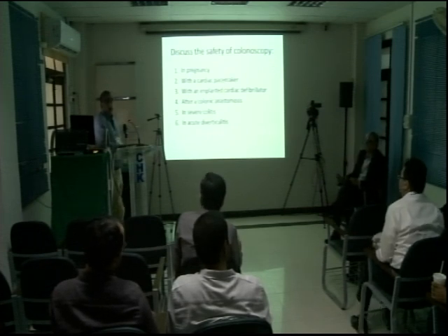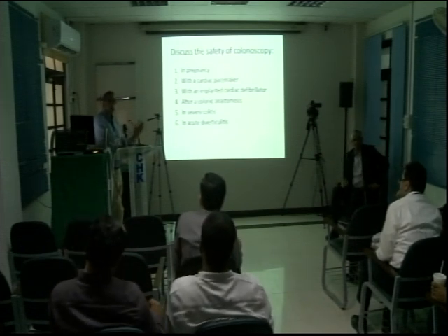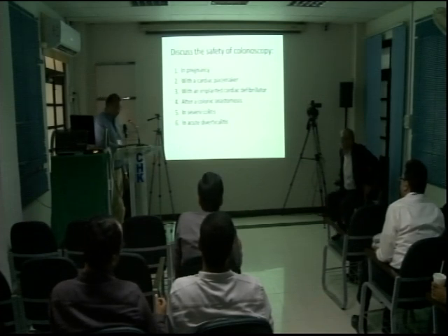Acute diverticulitis: again, if you find acute diverticulitis, with pus and blood coming out of the diverticula, abandon. Don't mess around, otherwise you cause a problem. Thank you, sir.